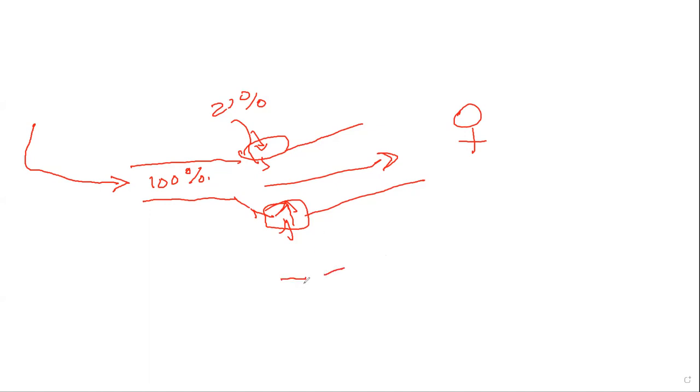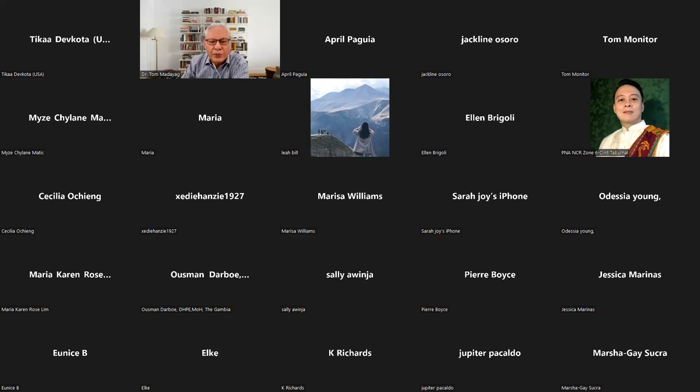so let's have a device that's this way and a device that's this way. Okay. So this is A and this is B. Which one will eventually provide the patient a higher percentage of oxygen? Is it letter A or letter B? Very good, letter B, because there's a smaller opening over here, and therefore the more concentrated oxygen from the wall will be eventually delivered to the patient. Excellent, okay. So let's go back to our presentation over here.